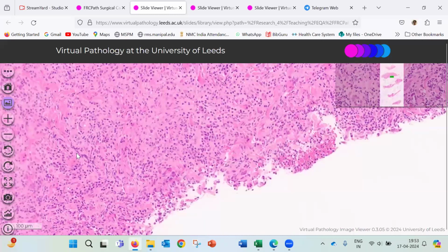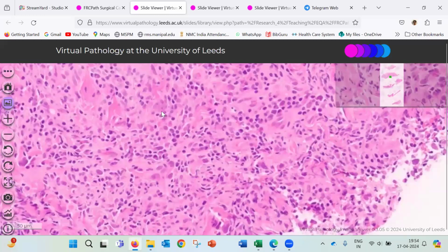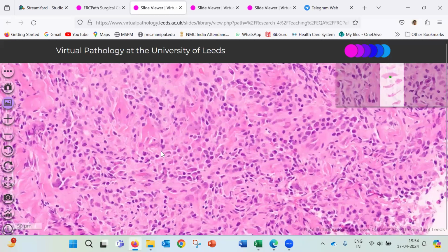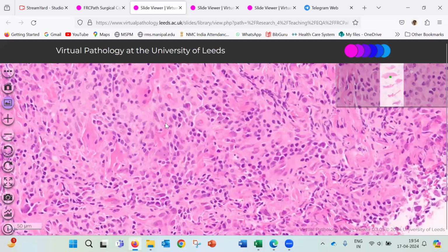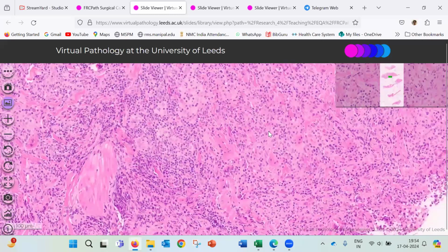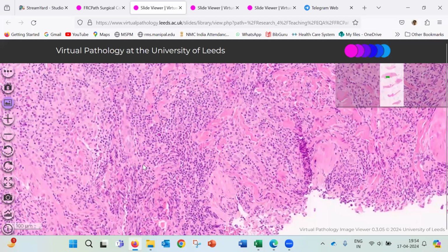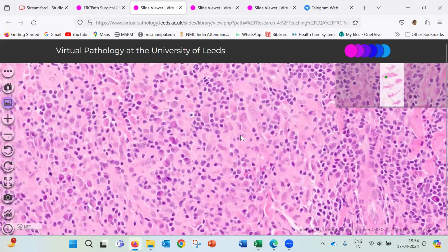I think the scanning is a bit not good, but even though you can see some very small perinuclear dots, which are quite suggestive of a Leishmania in this particular case. So you should suggest that I am suspecting some infective etiology. I favor Leishmania particularly in this case.